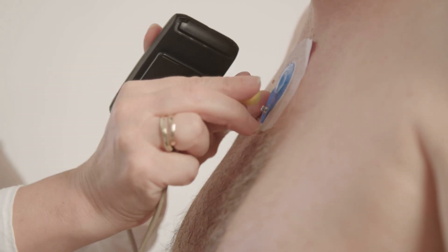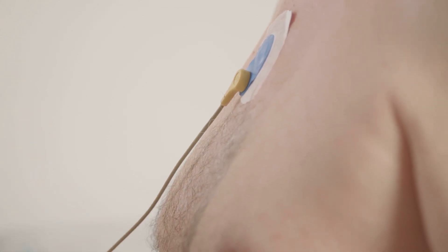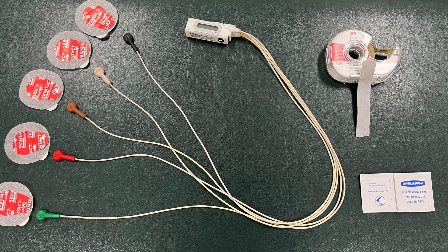A Holter monitor is non-invasive, but there is some preparation that may be needed. We ask you to wear some comfortable clothing when you come in to the center to have the Holter monitor fitted. It is applied by using electrodes that are attached to the skin, often around the chest and the tummy region. There are various types of monitors, but normally they might have up to five leads, positioned on little sticky dots called electrodes. Because the electrodes have to stay on with the leads for 24 hours, there is some preparation needed to ensure excellent contact between your skin and the electrode. For example, if there's a bit of hair around the area, a razor blade may be used to shave this off. Then the skin is prepped and cleaned, normally with an alcohol preparation. And to improve the contact between the skin and the electrode, there is often a very fine abrasive sandpaper applied to the skin.